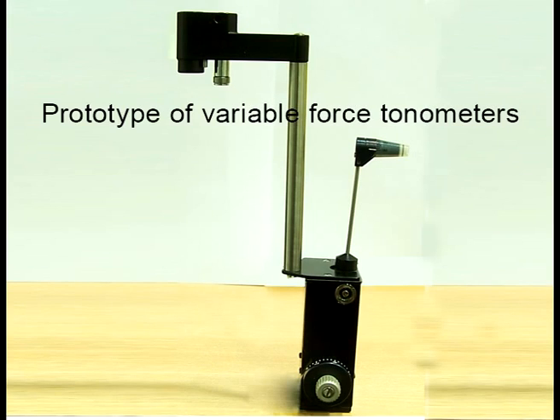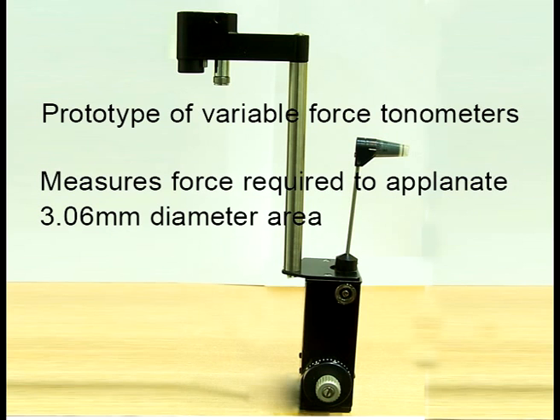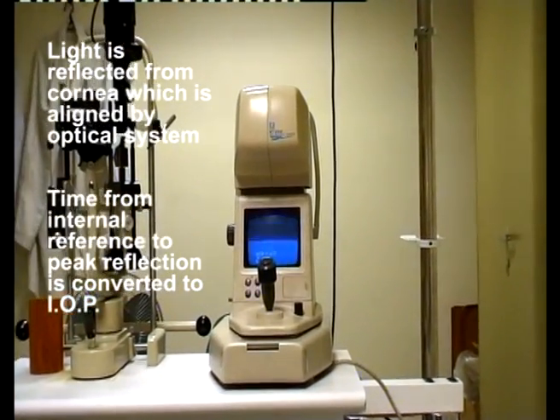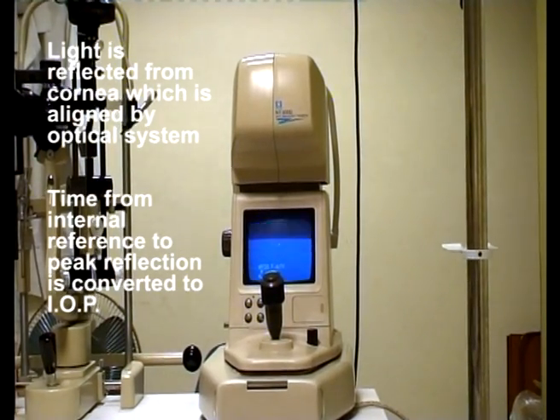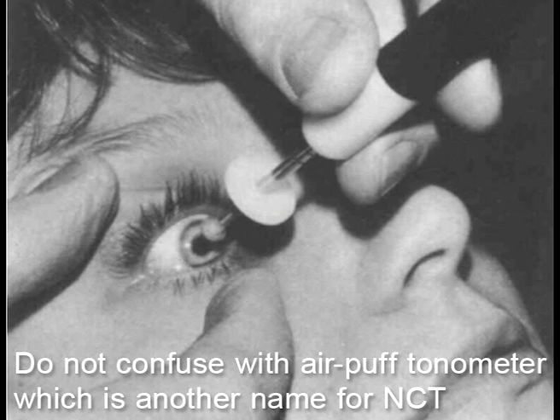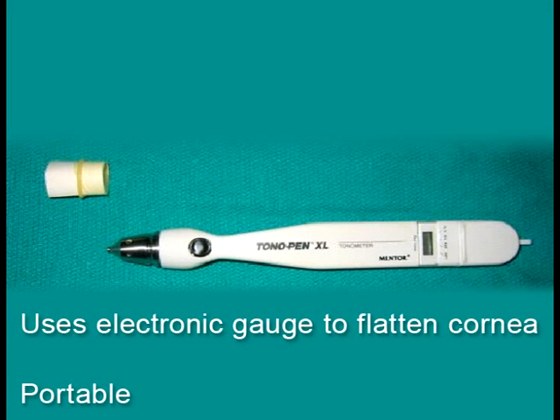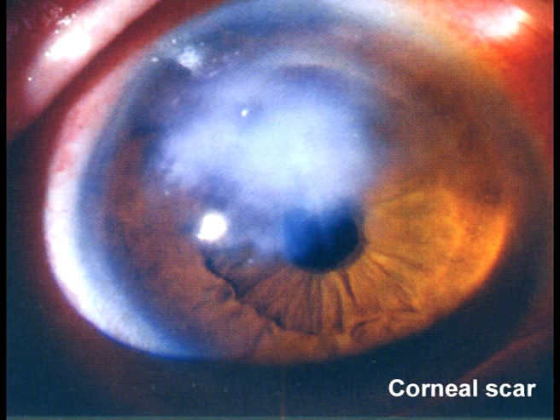Goldman aplanation tonometer is a type of variable force aplanation tonometer. It measures the force required to aplanate a standard area of cornea. Non-contact or air puff tonometer measures the time required to deform cornea in response to standard force and then calculates the intraocular pressure. Other aplanation tonometers include the Perkins tonometer, which uses the same biprism as the Goldman tonometer. Pneumatic and Mackay-Marg tonometers can be used in scarred or edematous corneas. The Tonopen is a handy instrument useful for measurement of intraocular pressure in irregular corneas and in bed-ridden patients.